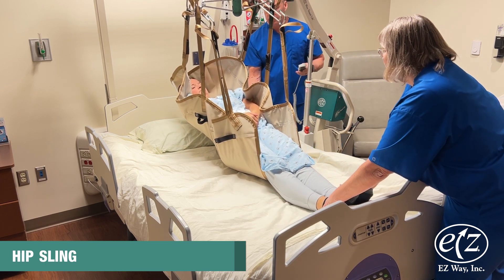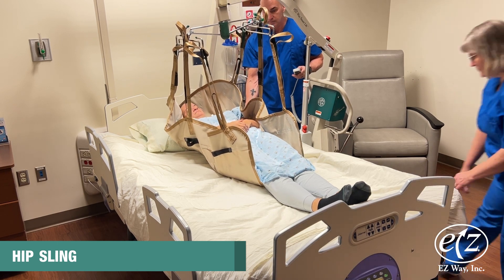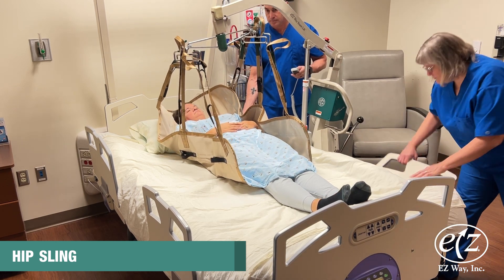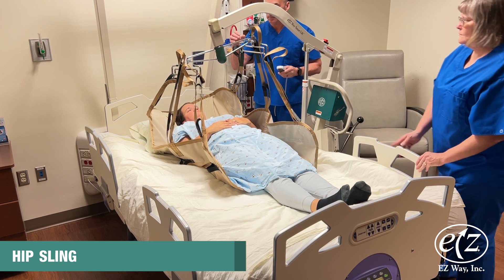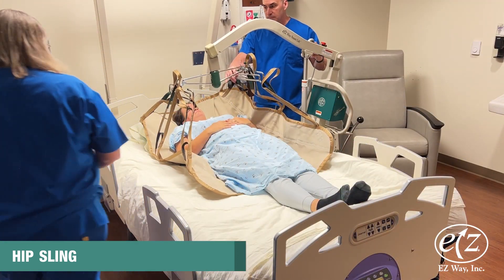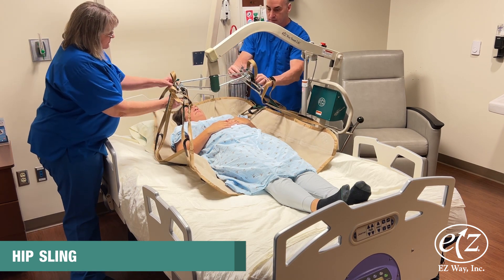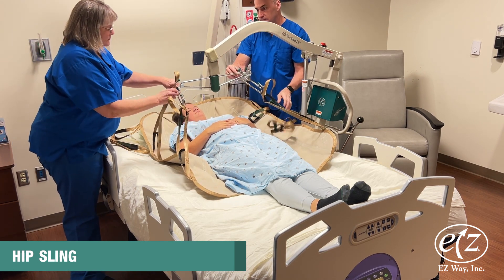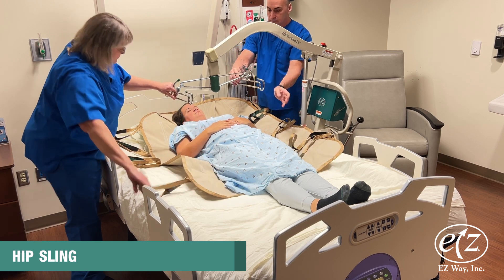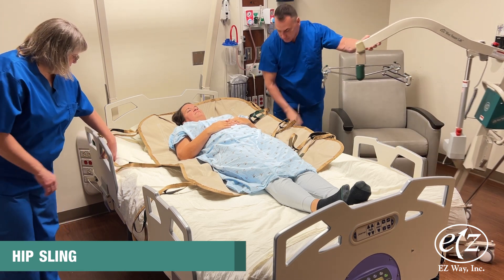Lower the person to the surface to which you are transferring, remove the straps from the lift, move the lift away from the person, and log roll the person to remove the sling. Note this sling is constructed of a heavier fabric and should not remain under a person after the transfer is completed.